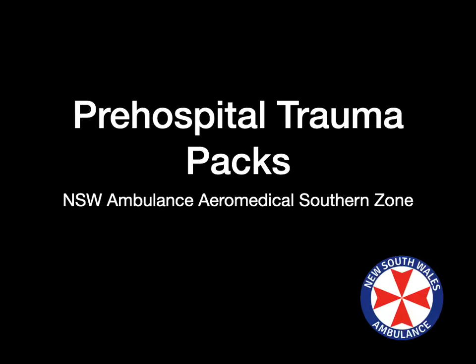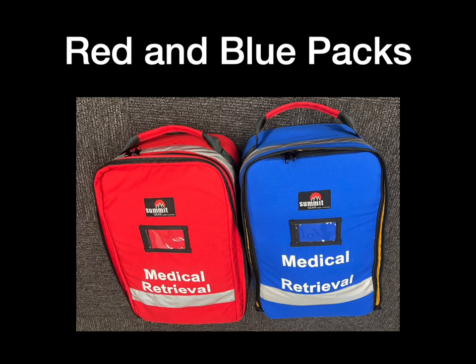This video introduces us to the pre-hospital trauma packs carried by New South Wales aeromedical teams. They are also known as the red and blue packs or the primary packs. It is vitally important that our teams have a thorough knowledge of the contents and layout of these packs in order that they can efficiently perform time-critical interventions.